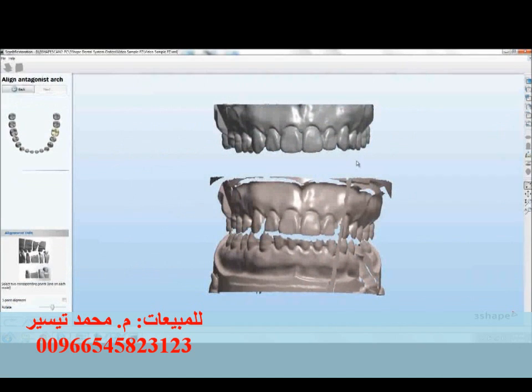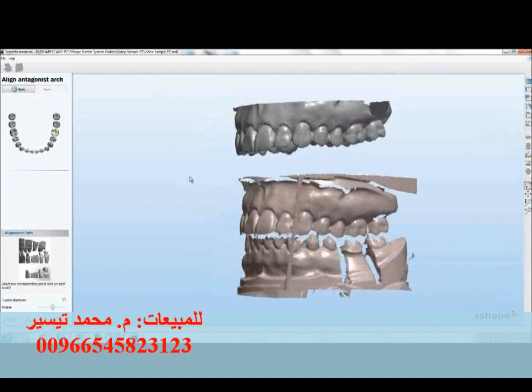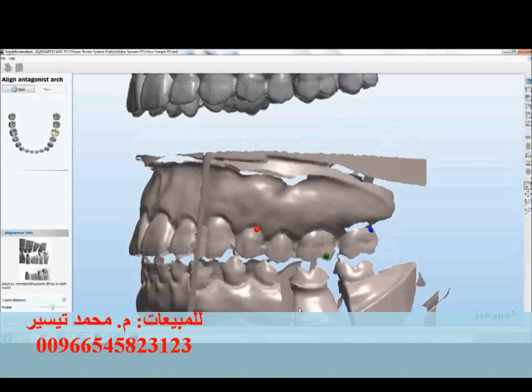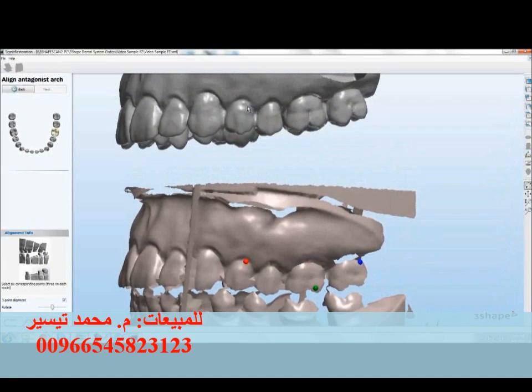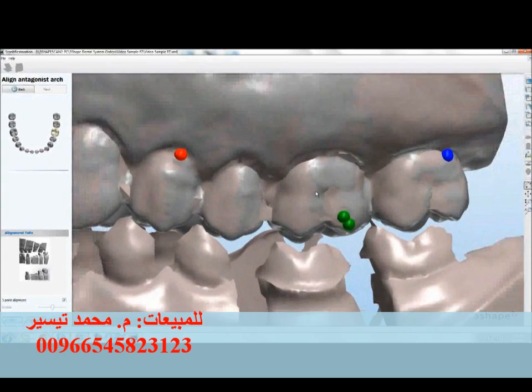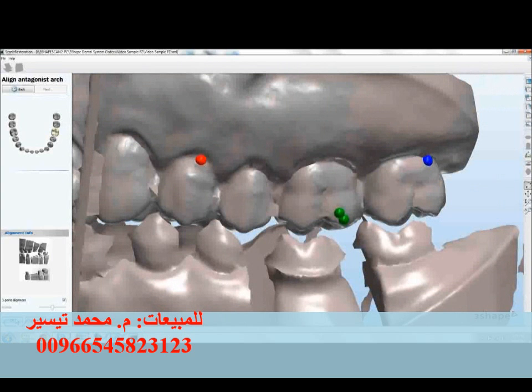Now we're asked to do the same thing with the upper scan. We'll go over to the operative side again and turn on three-point alignment. I like to pick the points not in a straight line but in a bit of a triangle for optimal registration. We'll pick those same three points up on the upper model — one, two, three — and hit apply. Now we have registration of the upper model. Hit OK to continue.